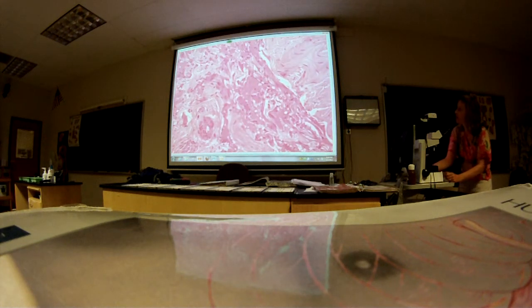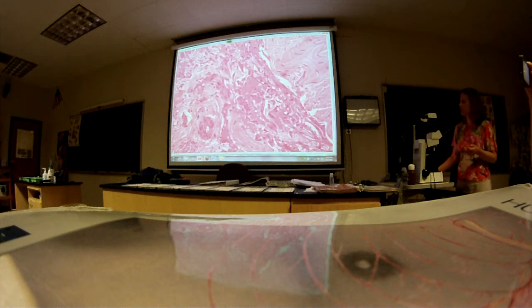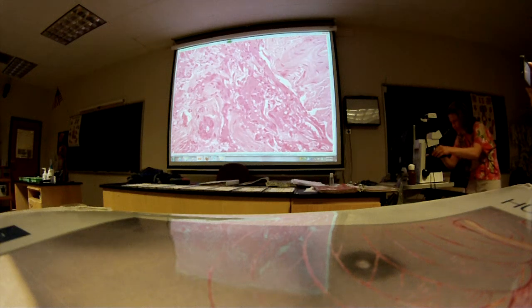So it's a mixture of fibers, and so it doesn't look like the smooth muscle maybe that you're used to seeing, but you can see little snippets of it. Maybe recognize it, like in here, it kind of looks like our typical looking smooth muscle. A little bit over here. And the elastic fibers, they really didn't stain for the elastic fibers here. You're not seeing what typically looks like elastic fibers. Okay, so this is the corpus cavernosum, and it's smooth muscle, elastic tissue. All three of those cylinders are. So we'll use this slide in conjunction with the diagram to help you get the big picture.